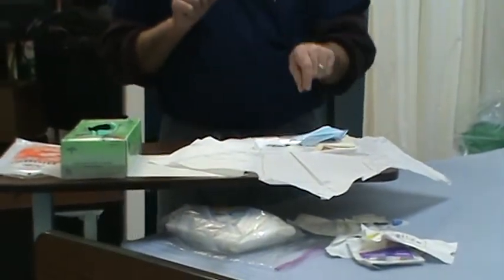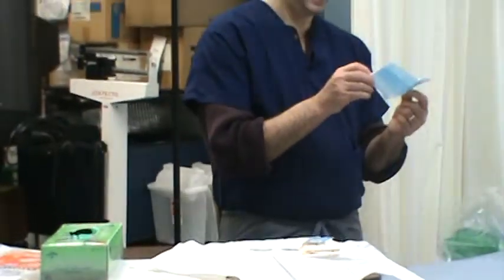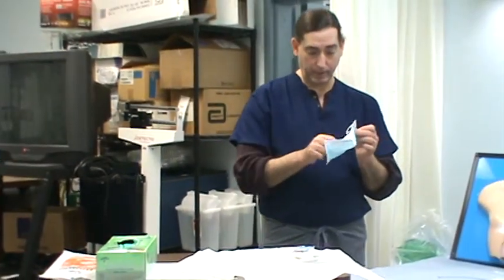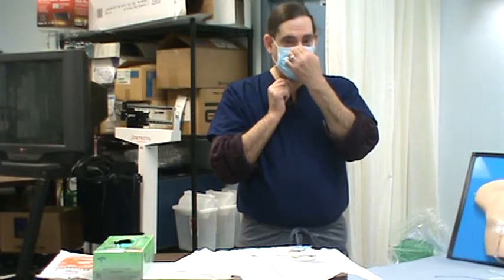So I have to carefully reach through and only touch my mask, and generally your mask is going to be right on top. I could just reach right down and grab it. And notice I'm kind of stepping away a little bit. That's because I'm breathing down these germs. I don't want to be breathing them on my kit. The wire is at the top, and I can pinch it to close it on my nose.